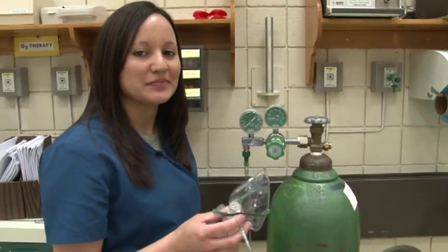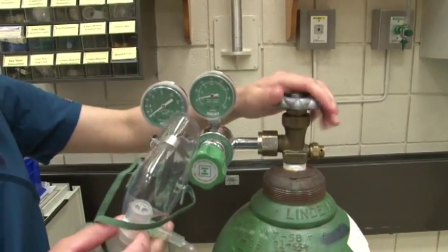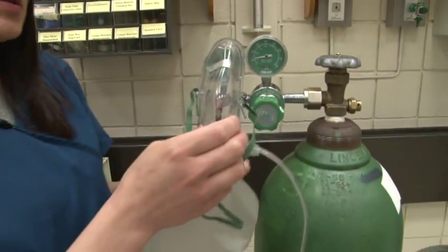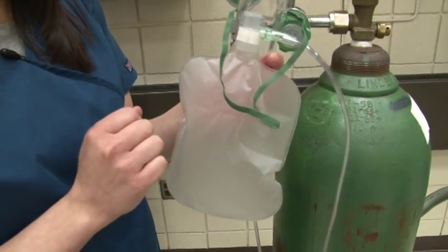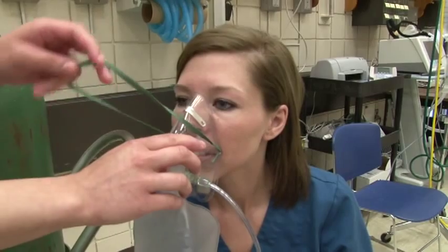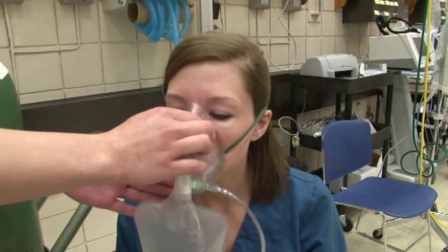Now I'll demonstrate how to properly place the mask on a patient. First, if you're using a tank, you want to turn it on. With the partial-rebreathing mask, set your flow to 10. Remember, with the partial-rebreathing mask and the non-rebreathing mask, you want to make sure the bag is inflated all the way so the patient gets the correct amount of oxygen. Once the bag is inflated, go ahead and place the mask on the patient — it wraps right behind her head. Also make sure the metal pieces are pressed firmly to her nose so the mask stays in the proper position.